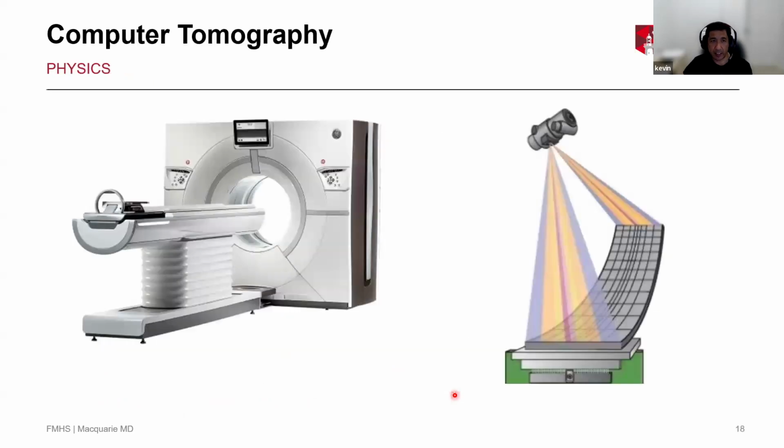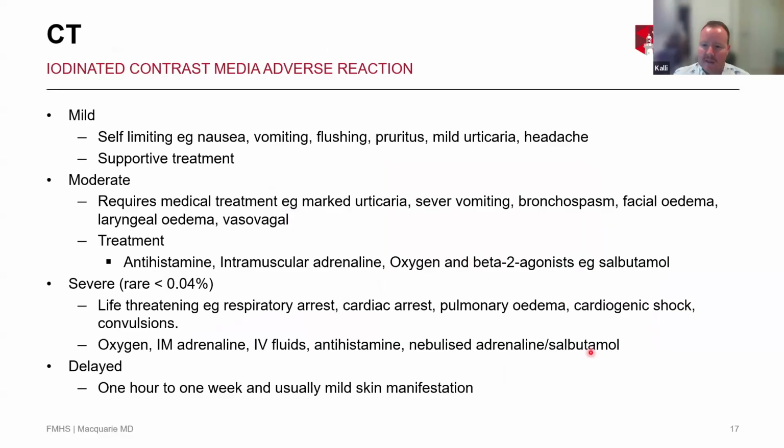Okay, so what does a CT scan look like? Well, Kevin, before you go there, why does the CT contrast scan make you feel like you've wet yourself? Is that something patients have told you? Absolutely. It's from the vasodilatation in the pelvis. I get it a lot when I do angiography, and we do runoffs where you have the contrast going straight down the aorta into the pelvis, and people get that sensation that they've wet themselves. Yes. Explanation.